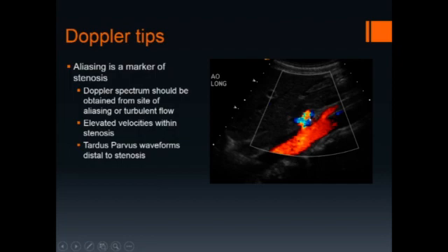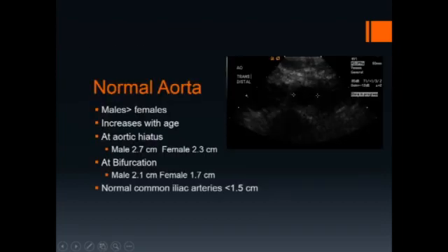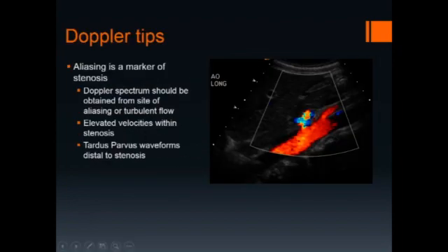In this case, from the origin of the celiac axis, where an area of aliasing is seen indicating a stenosis at the celiac axis. Elevated velocities are seen within the stenosis, and tardus-parvus waveforms are seen distal to the stenosis.